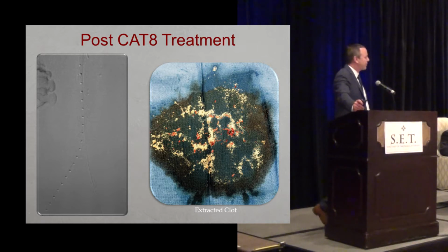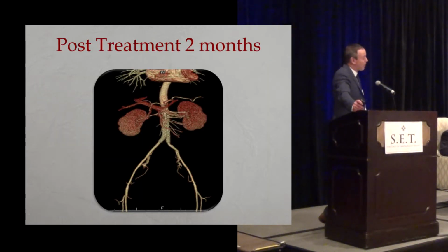again, as it's aortic disease, I elected to treat her then with covered stents, again, based on her relatively young age. She's now follow-up of almost now 24 months, and she continues to do well with no evidence of restenosis.